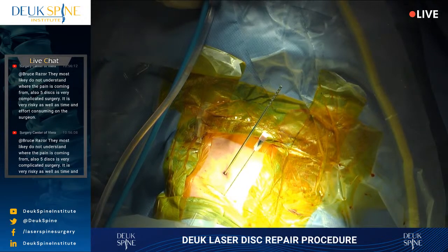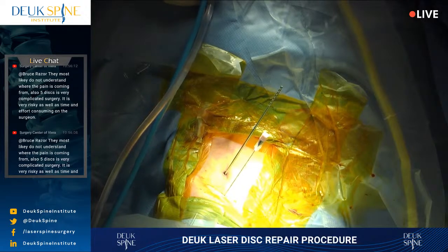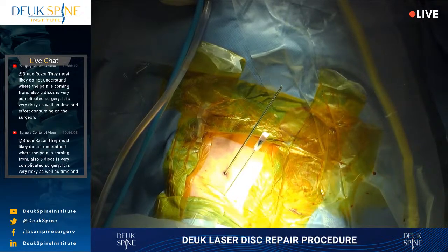So I just want to make sure I'm seeing a good picture. Change the wag a little bit. Two, 3, 4, 5, 6. Yeah, 5, 6 is the most collapsed. I think that's probably as good as we're gonna get it.